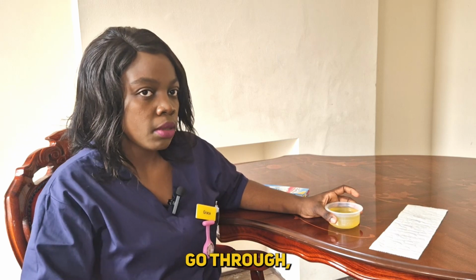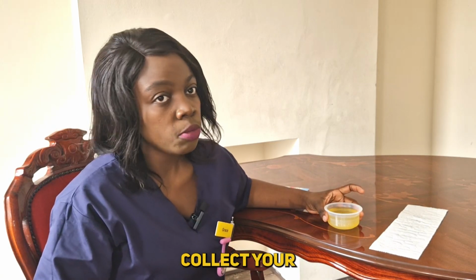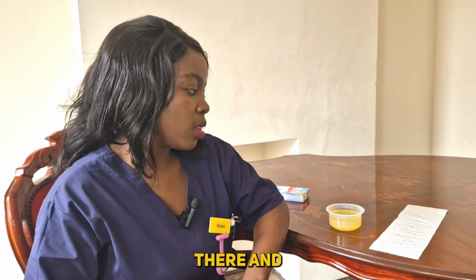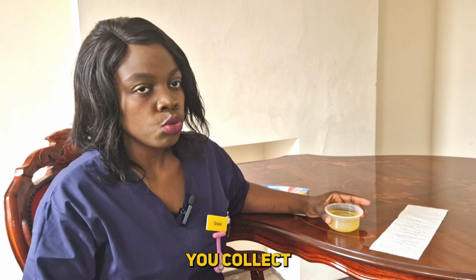Let the first pee go through, then put your container down there, collect your middle pee, and you can test using your middle pee. This is just to prevent you from picking up a lot of dirt, maybe tissues that were there and everything. Make sure that your bottle is very clean before you collect your urine.